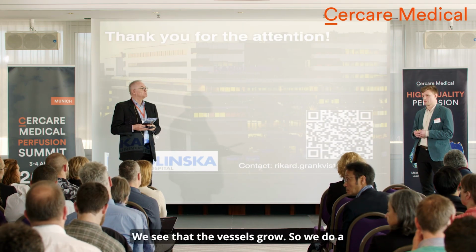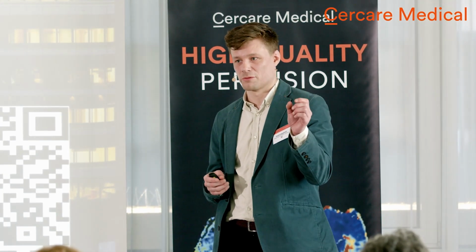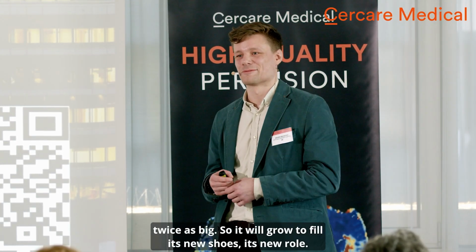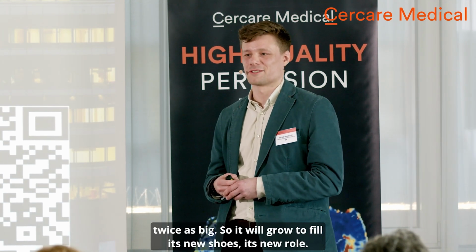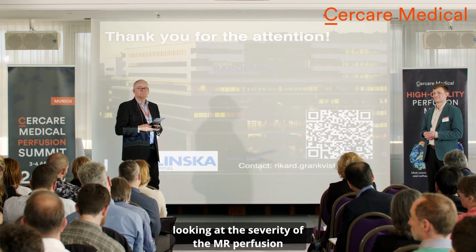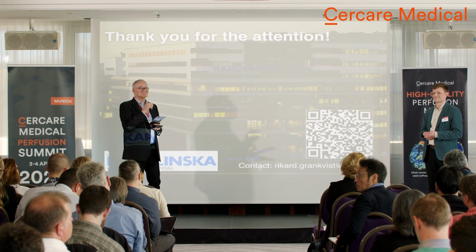We see that the vessels grow. We do a DSA pre-surgery and measure the vessel to make sure that it's big enough. Then on the follow-up MRI, the vessel is like twice as big, so it will grow to fill its new shoes, its new role. I think it would be interesting to see the collaterals at the same time as looking at the severity of the MR perfusion deficit post-op. Yeah, I look forward to hearing that.